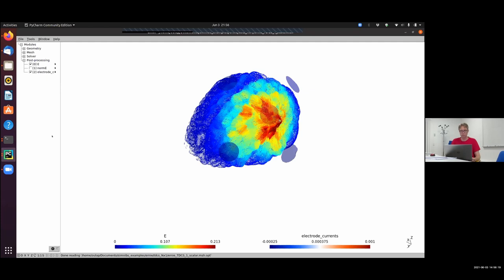It also shows up in our support email, when we get emails because something didn't work out. It's most often something with headreco, simply because the link with MATLAB on the specific cluster did not work out. So we will replace it rather fully, and this will be somewhere in the second half of this year, probably a little bit later, so that there will be an update where this is obsolete, and you don't have to worry about that anymore. Then it will be really the case that once you have downloaded SimNIBS, it will run standalone without any external libraries, also the segmentation. And this will also make distribution or work on clusters much, much easier.